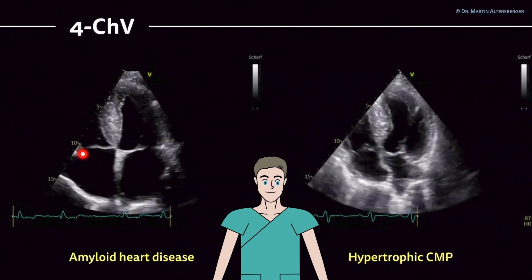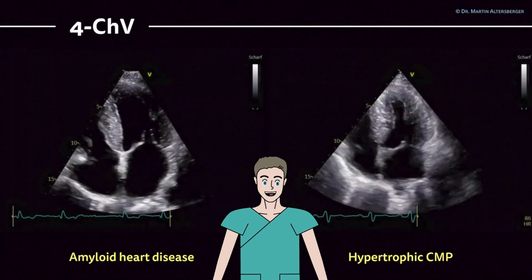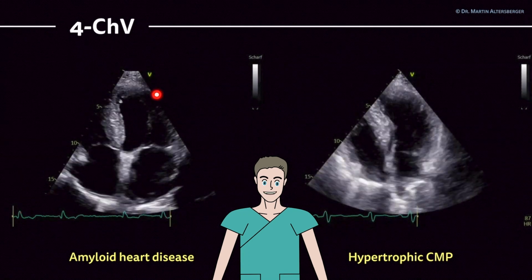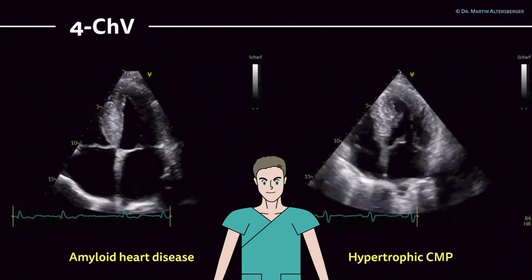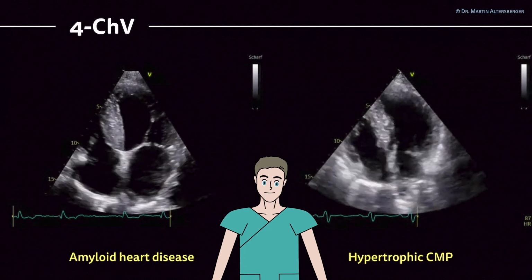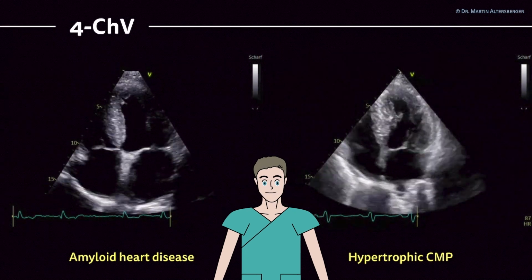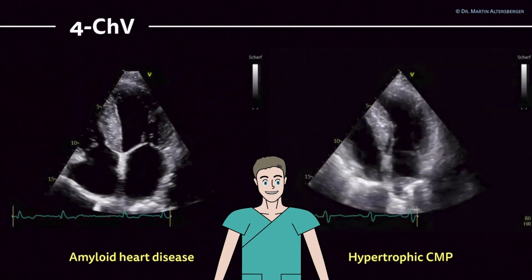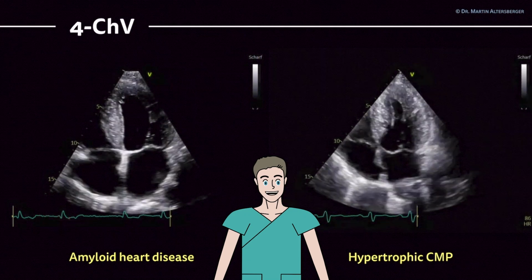Here the anterior-posterior leaflet of the tricuspid valve, and here the septal leaflet, the severely concentric, thickened left ventricle. You do see here the chordae tendineae, the papillary muscles, and a patient with, even with this severely thickened LV, a reduced left ventricular function in amyloid heart disease.